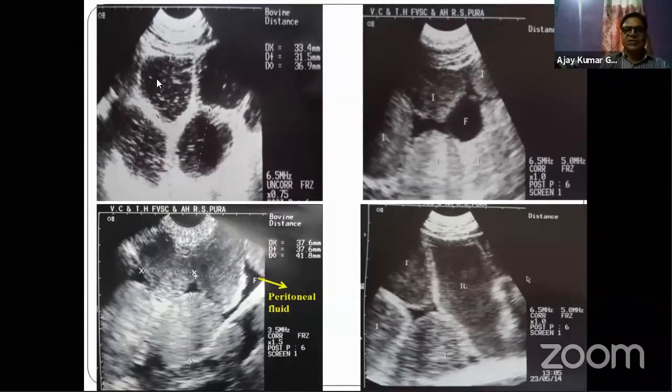See, in this case, you can see the lumen of the intestines. It contains hypoechoic material, so the wall of the intestine appears hyperechoic. In these cases, you see the contents are hyperechoic when compared with this picture. So the wall is not that clearly visible because the echogenicity of the wall and the echogenicity of the contents is the same in these pictures.